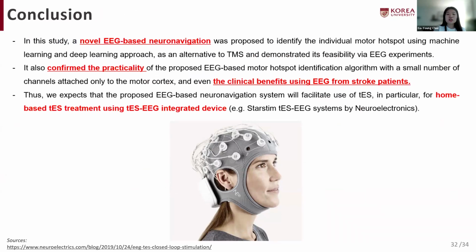Based on this result, the integration of our developed algorithm into commercialized portable TES EEG devices facilitates the automatic and precise identification of motor hotspots, enabling the simultaneous application of TES without the need for the TMS-based manual procedure of identifying motor hotspots.